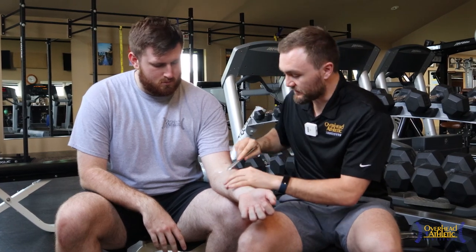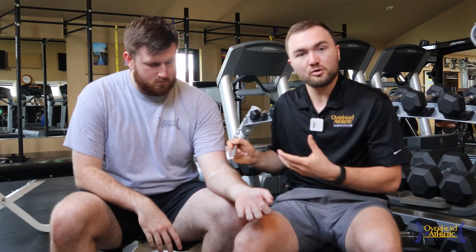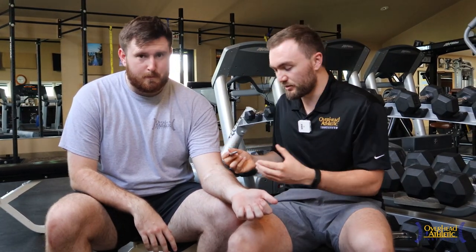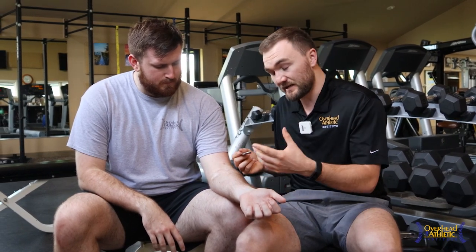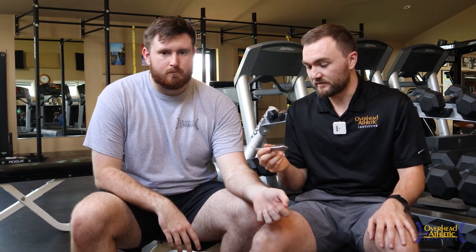This is something you can do yourself. I've got a little bit of mobilization cream here — you can use cocoa butter, any form of lotion usually works pretty well. Something that decreases the friction with the skin a little bit to make it more comfortable. You can get one of these tools nowadays for like 40 or 50 bucks; a few years ago you might have had to spend 150 to 200 dollars. I do like the metal ones more than the plastic.